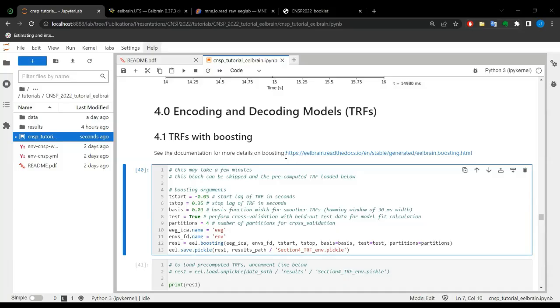But apart from the language, what my understanding is for a very simple situation, when you have 10 trials, with 9 training trials and 1 testing trial: if those 9 training trials do not have an equal number of sensors, like one has 124, one has 120 or something like that, my question was, does it give any error while you are implementing the mTRF train, mTRF crossval, or whatever the Eelbrain functions?